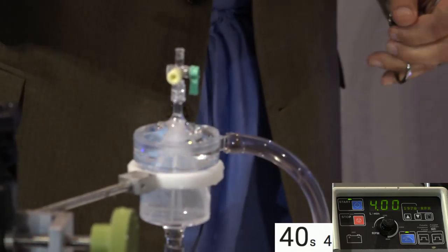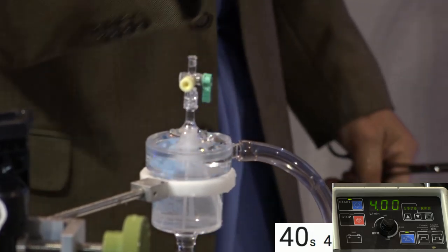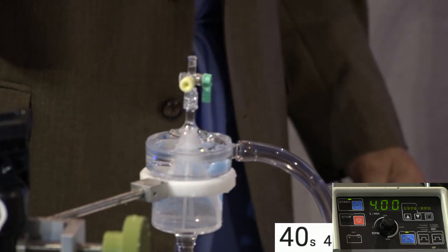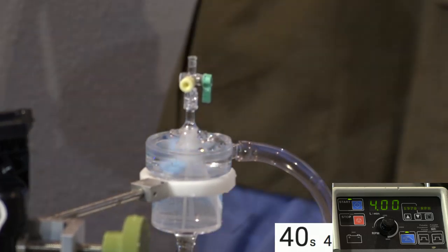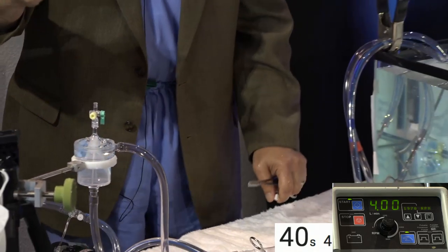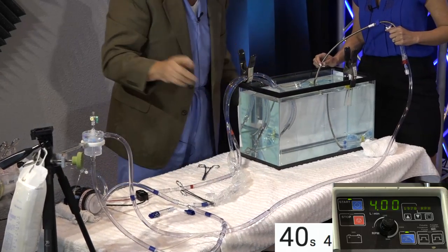There was a little bit of a problem. And I also think the other problem was that there was so much of a bend that we were coming up to the glass. What would have helped is to have put it here and pulled straight up with it, and that might have done it. But we can do it again, because that's the beauty of flarp. So let's do another one.